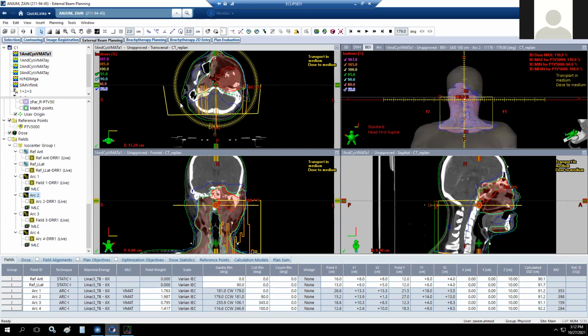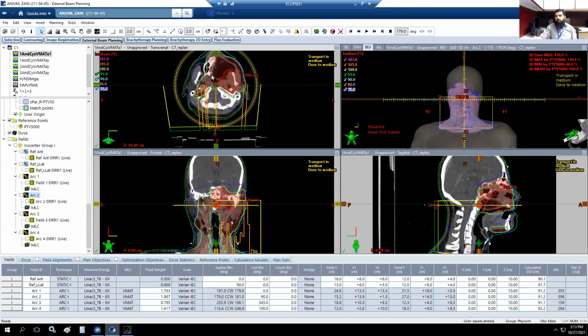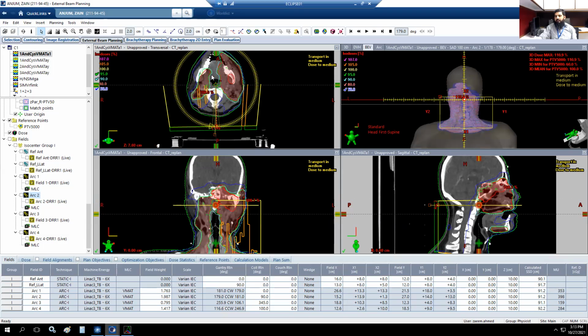If the same plan is planned with one isocenter versus two isocenters, with two full arcs, is there any difference? Here four arcs are used, two full rotations and two half rotations with one isocenter. You can plan with a single arc or with different arcs. It depends on the experience how you are going to cover the PTV, because you have the freedom of selecting the arcs with different angles.